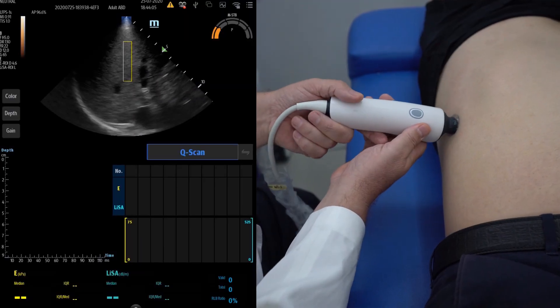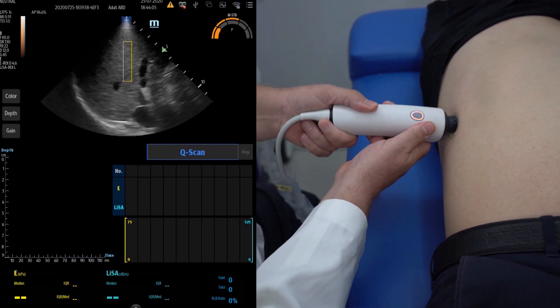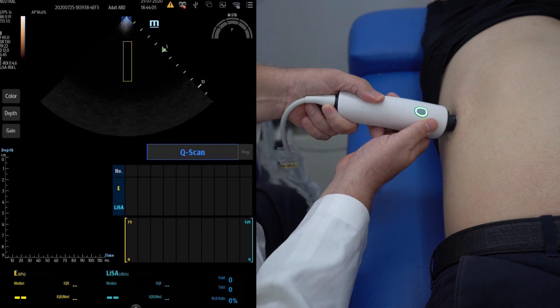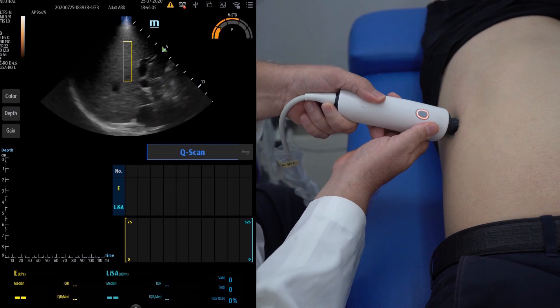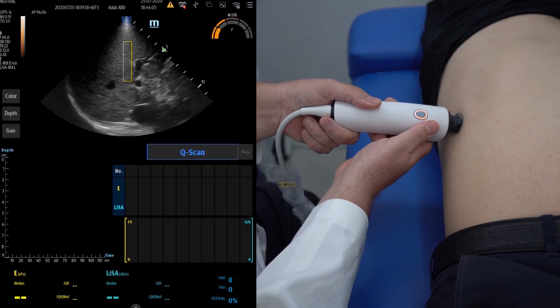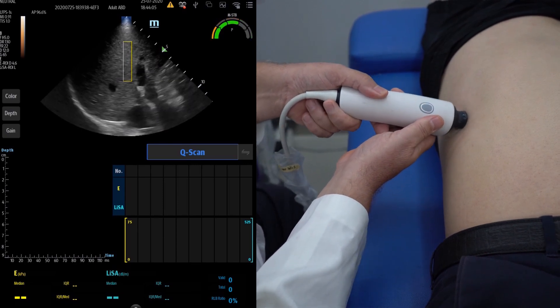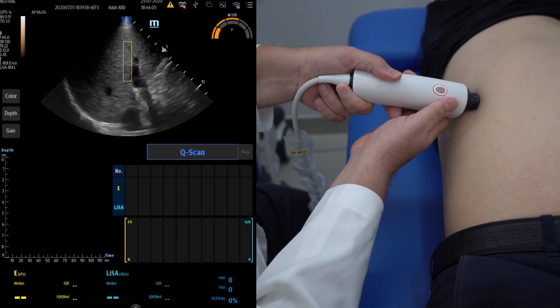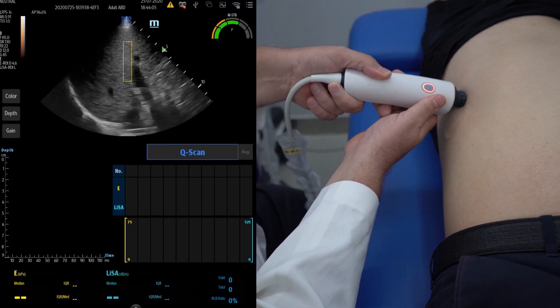The patient should be relaxed on the exam table or bed, and you should ask the patient to raise their right arm toward their head or above their shoulder. Then obtain a good image by placing the probe on the right side of the patient, and if possible, find the best image using the last two lower ribs so that the liver tissue fills up the region of interest box displayed on the screen. Also try to avoid any images that display the bladder, big vessels, biliary tracts, or any other lesions.